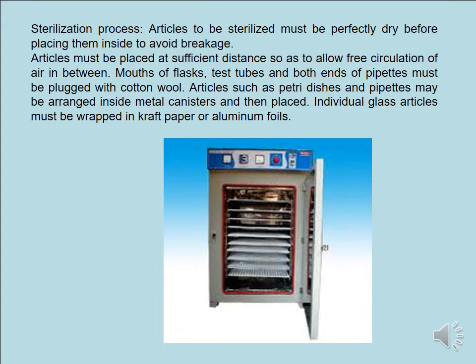The process of sterilization. The articles to be sterilized must be perfectly dry before placing them inside to avoid damage. حقيقة يجب أن تغسل الإنسترومنت كلها وتجفف قبل أن نضعها في الهوت air sterilizer. The articles must be placed at sufficient distance so as to allow free circulation of air in between. يجب أن توضع الإنسترومنت بمسافات بحيث من خلالها يمر الهوت air.